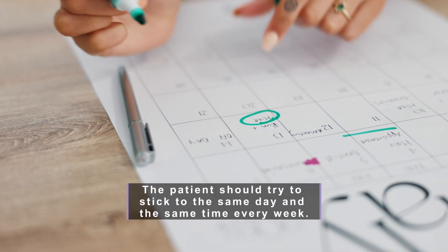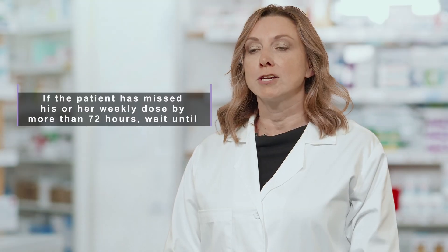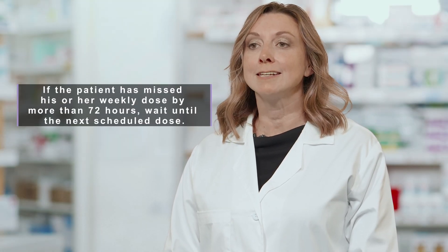Usually the dose is only once a week. The patient should try to stick to the same day and same time every week. If the patient has missed their weekly dose by more than 72 hours, wait until the next scheduled dose.